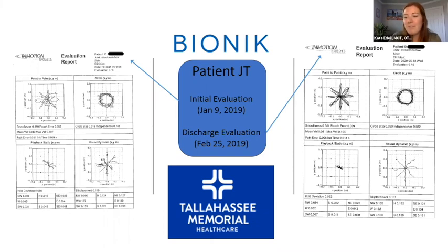All right, I think we have time for maybe one more question here. Sue, I will address this to you first. What is your billing process when using the device? Is it all out-of-pocket payments, or can you use regular therapy billing codes? Any creative revenue strategies? So I haven't had any out-of-pocket. Insurance has covered it because it is evidence-based. And I always document neuromuscular or therapeutic activity, and I have no problems with billing at all.